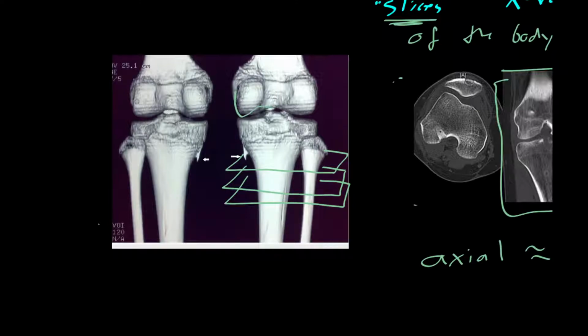So this is very popular for planning surgeries for things like femoroacetabular impingement, which is a deformity of the hip, which I think I put in the problem set. It is also popular for looking at children with developmental musculoskeletal conditions like cerebral palsy, who often have a misshapen bone structure. So maybe their tibial plateau will not really fit very well into the trochlear groove here. Super useful for getting a really, really detailed 3D picture of what's going on inside the body.